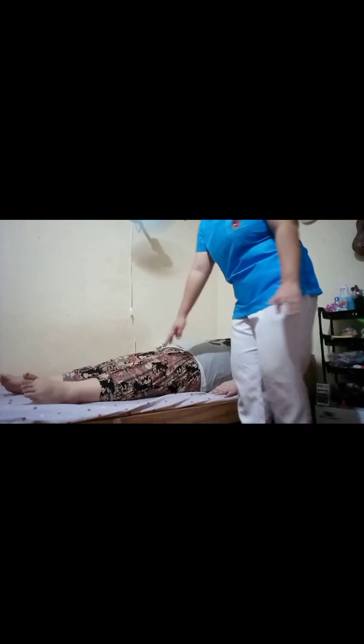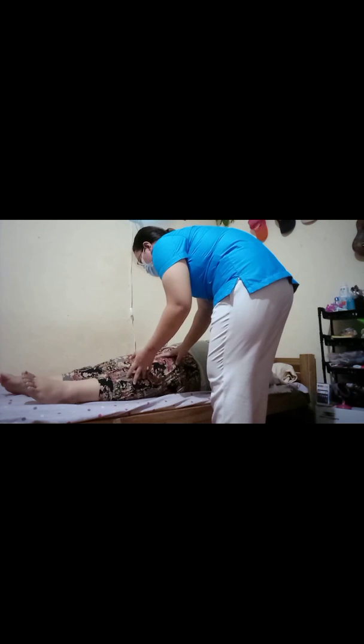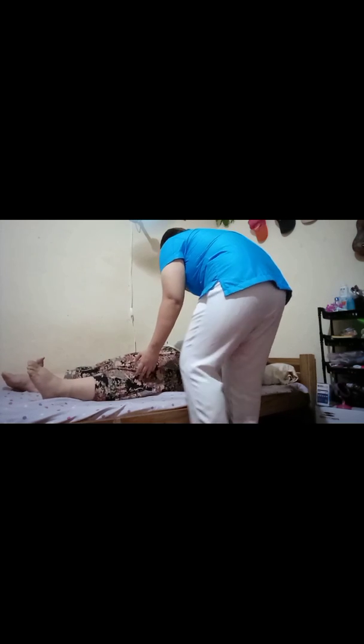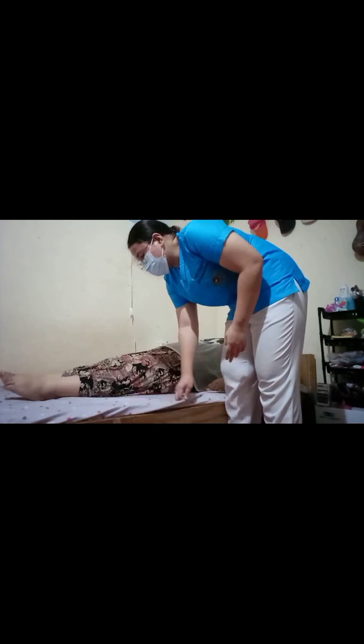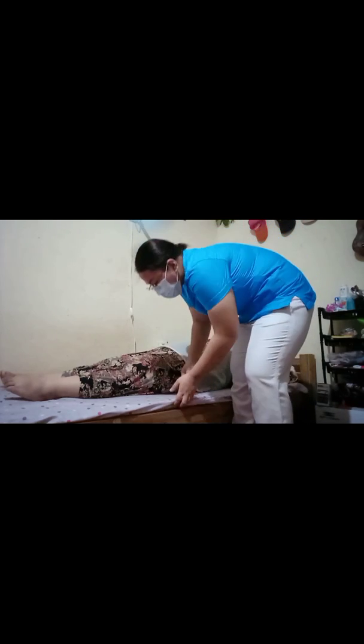So, position the patient to align the femur to the midline of the IR. So, make sure nga ang patient na to kay nasa midline. Assuming that the patient is now at the midline of the table, which is perpendicular to the IR. So, straight lang, ma'am. Relax lang ta, ma'am, ha?